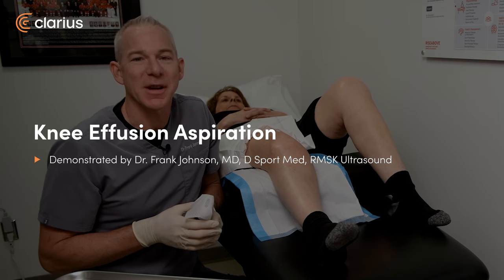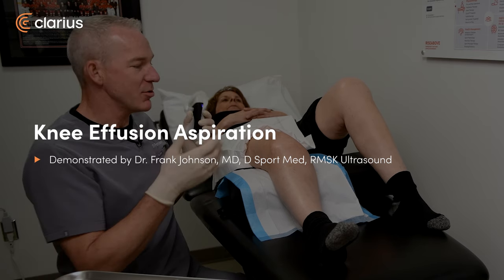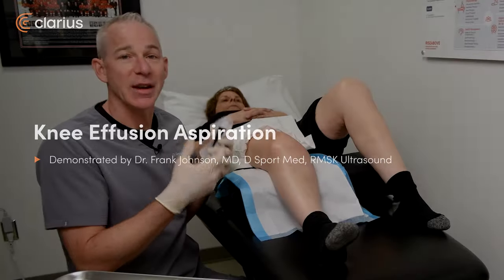Hi, Dr. Frank Johnson from Sports Medicine Ultrasound. I'm here to drain a swollen knee and inject PRP.